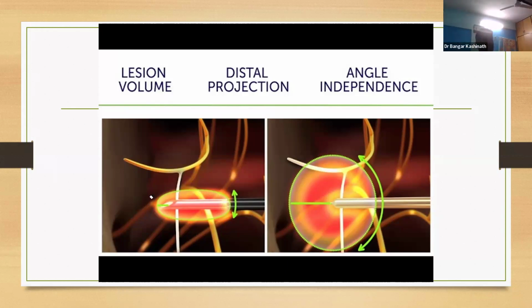So what directions will be needed if you are doing cooled, conventional, and pulse? Sir, if it is cooled, then it doesn't depend upon the direction. So it is directionally independent, right? It is directionally independent, sir. Fantastic.